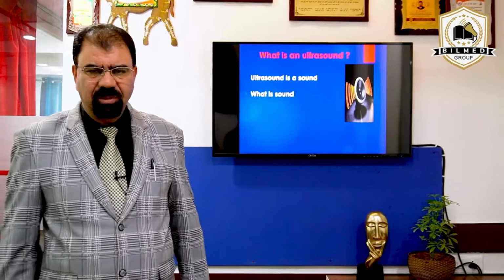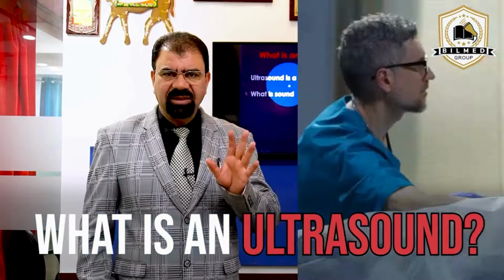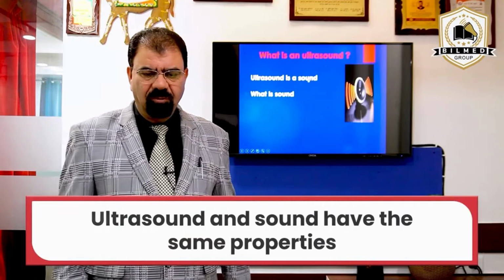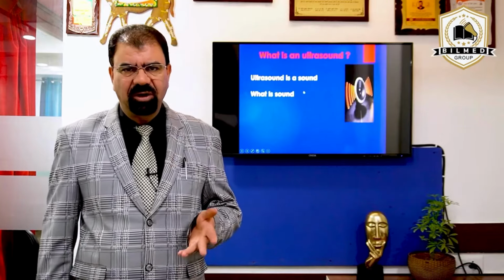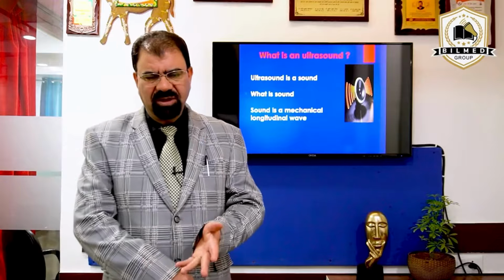Today we will discuss ultrasound. What is an ultrasound? Ultrasound is nothing but a sound. Property wise both are the same. So when we define the sound, automatically we are defining the ultrasound also. Now what is a sound or ultrasound?